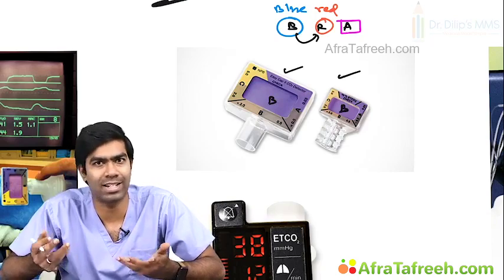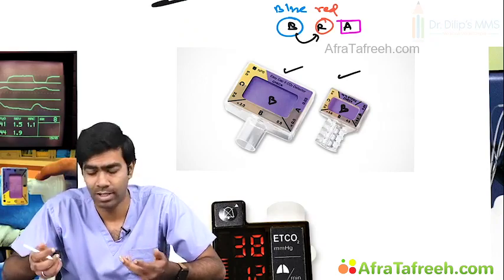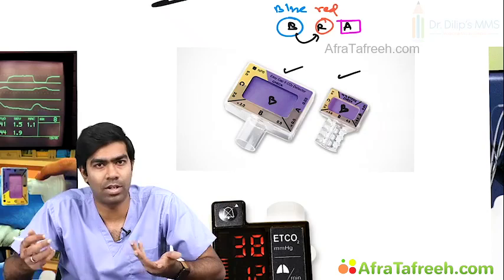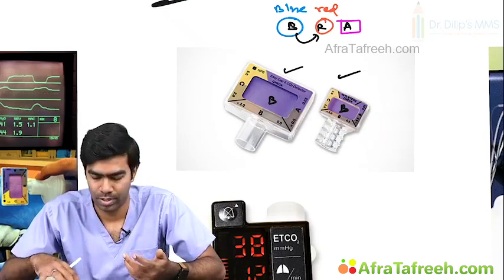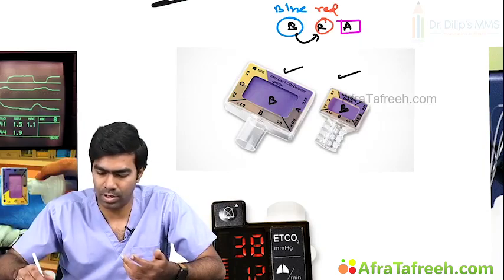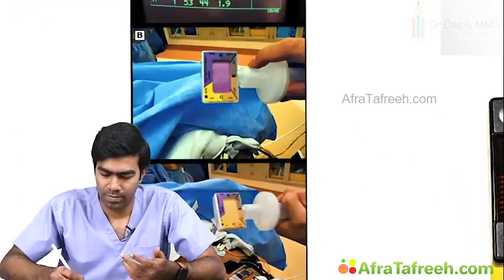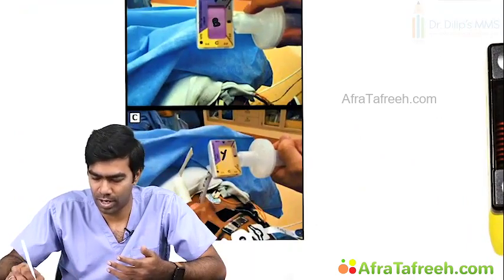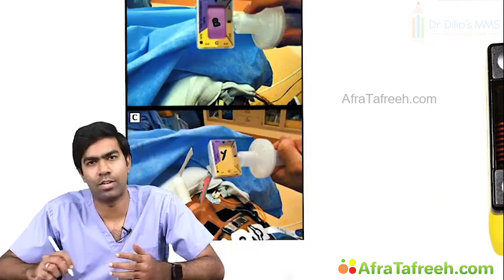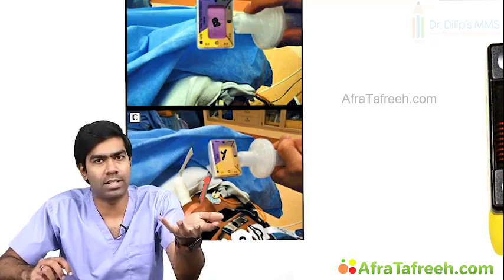Carbon dioxide is like an acid, it carries protons. So it's like a volatile acid, so it has to turn to a different color. In our colorimetric testing, it's not blue, it's yellow. You can see in this particular example a blue colored litmus paper which is turning into yellow as soon as you connect it to the endotracheal tube. We discussed this already in detail.